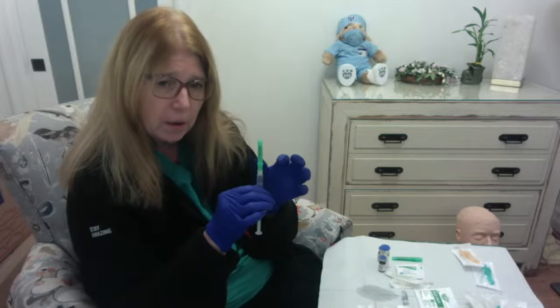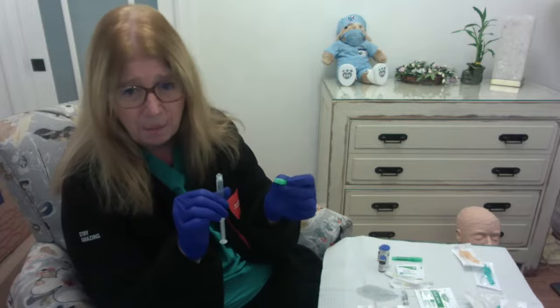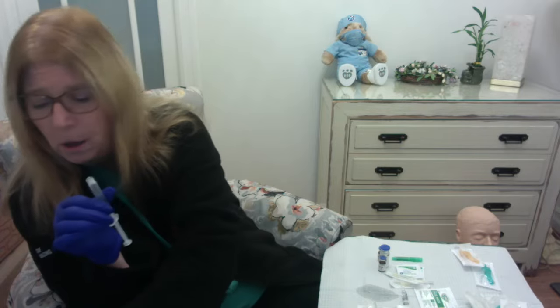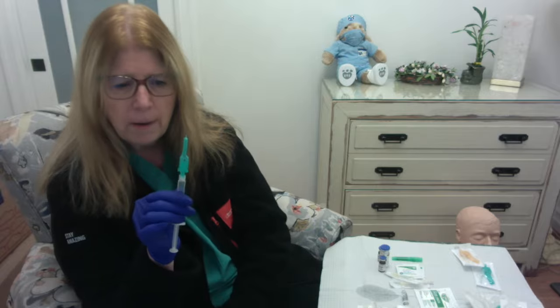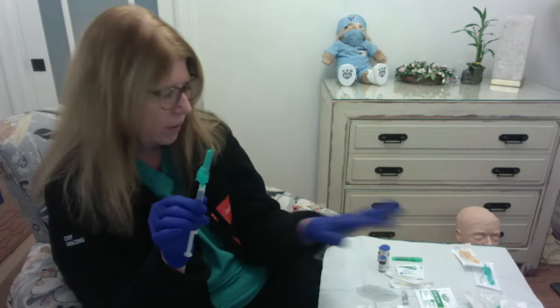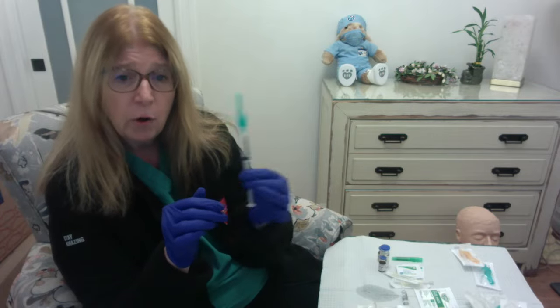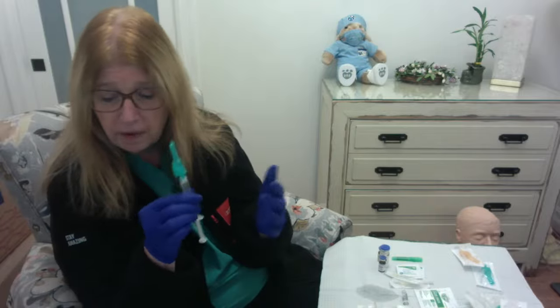Remember, this filter needle, you cannot use it on a patient or use it again, basically, after you have taken out the fluid from the ampule. So we would replace the needle. Right? Now I put one of these safety needles on because I'm trying to conserve my supplies here. But now we would be ready to go to inject this into a bag, or perhaps go to the patient's bedside and give an injection. All right, so that's one way that you can open up an ampule.